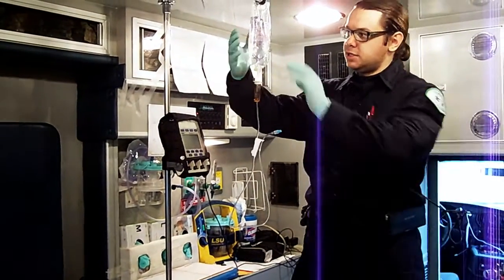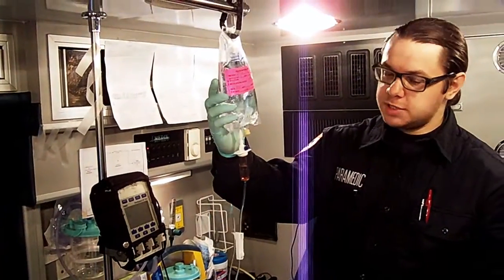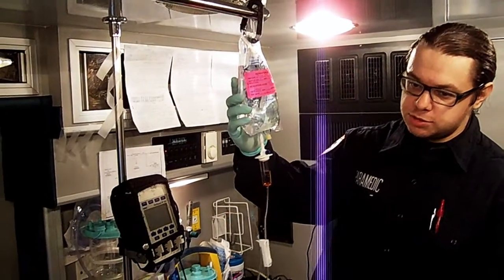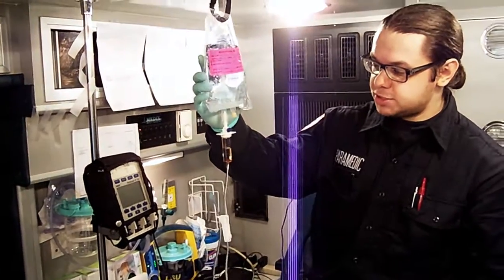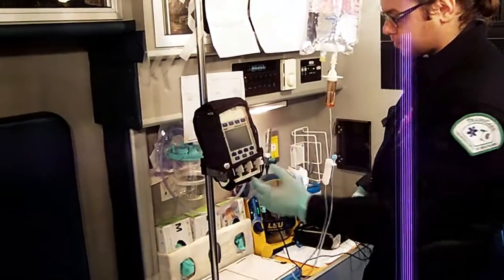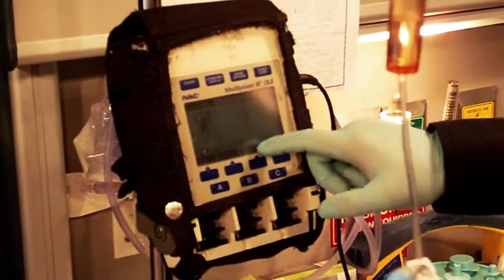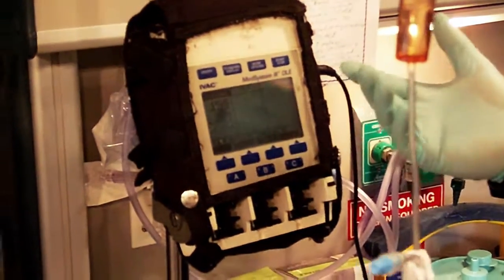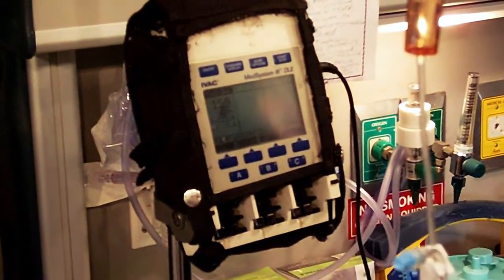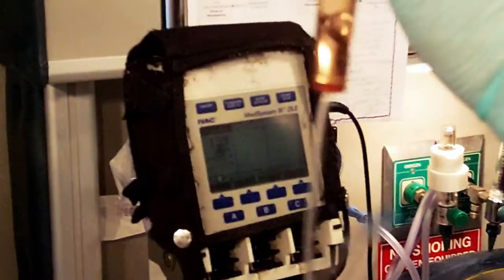If you arrive at the facility, here we have a normal saline — maintenance fluids. The physician tells you to continue infusion of normal saline at a rate of 100 mLs an hour for the duration of transport. This is running on the hospital pump, so you have your Alaris MedSystem 3 here. You're going to turn it on. You can set it to general purpose OR2, or if you have a neonatal patient, you set it to neonatal. We're going to keep it at OR2, with 100 mLs an hour and 500 mLs in the bag.